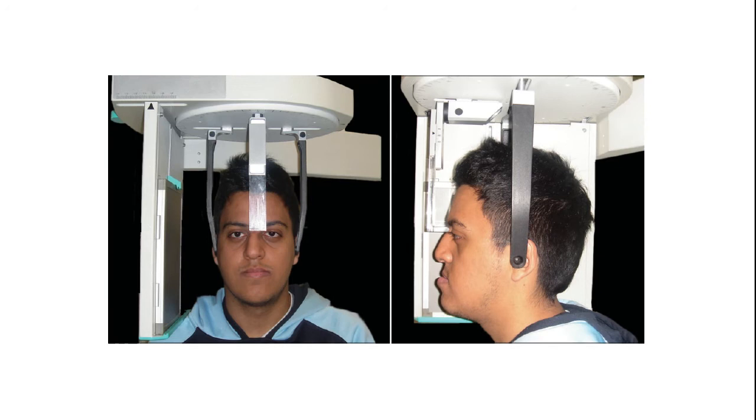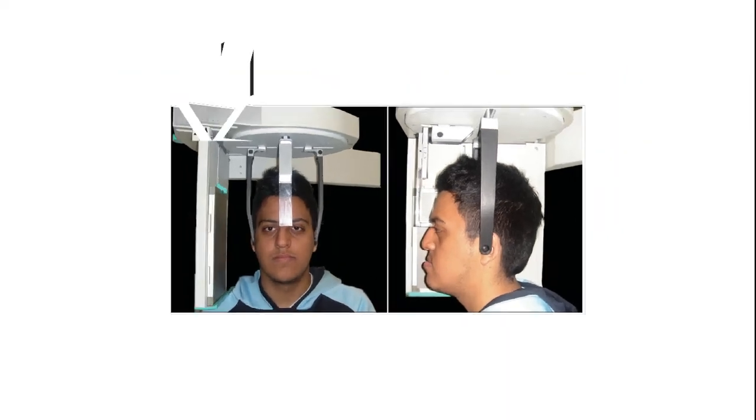The head positioning device, cephalometer or cephalostat, and the technique of radiographic cephalometry were introduced in 1931 by the orthodontist Holly Broadbent in the USA and Herbert Hofrath in Germany, simultaneously but independently of one another.